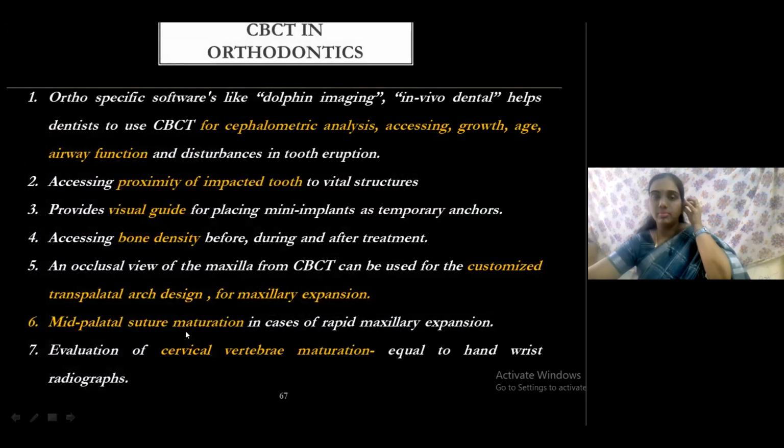Okay, now I'm finishing off with the applications of CBCT in endodontics, and moving on to the applications of CBCT in orthodontics. The applications of CBCT in orthodontics are mainly for growth analysis. Mainly it is referred by the orthodontist to check the position and relation of the impacted tooth, and also in cases of orthodontic surgeries to check for airway functions and the position of the impacted tooth or the unerupted tooth.